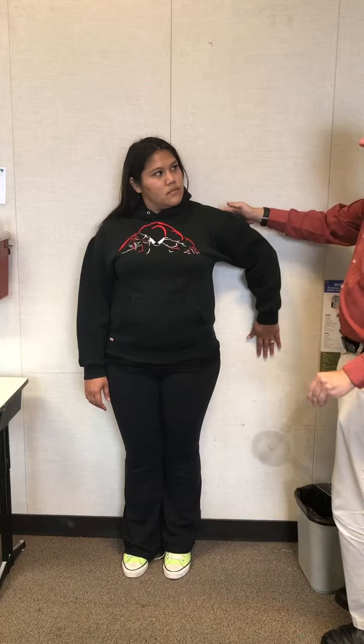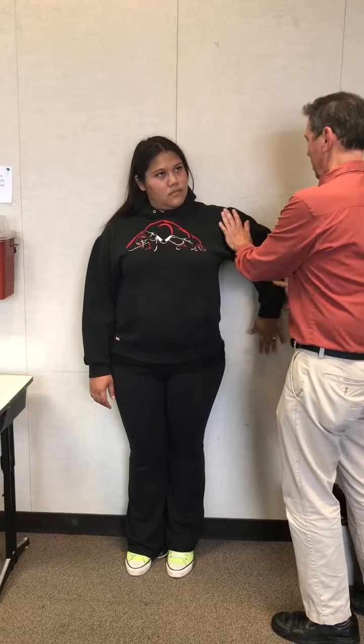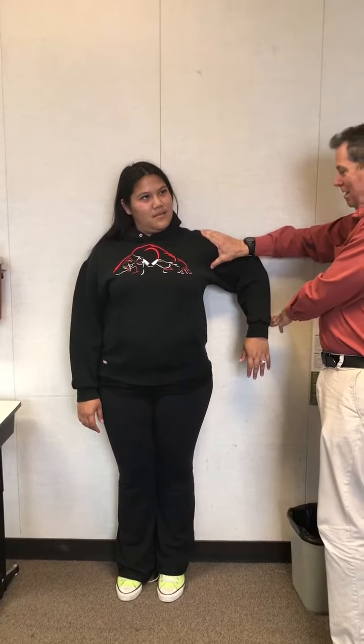But actually, go up to neutral again. Put your shoulder back against the wall and go down. You have to make sure that the shoulder stays against the wall — that's really hard to do. Go down as far as you can. See, cannot touch the wall. By keeping the shoulder stable against the wall, one can't compensate, and without that, you're getting a false reading on internal rotation.